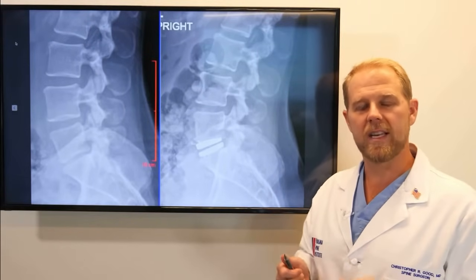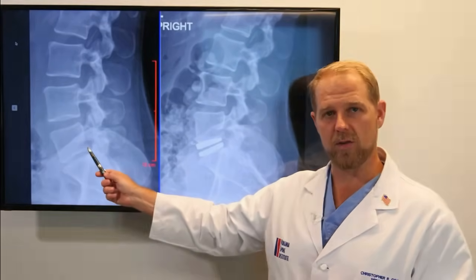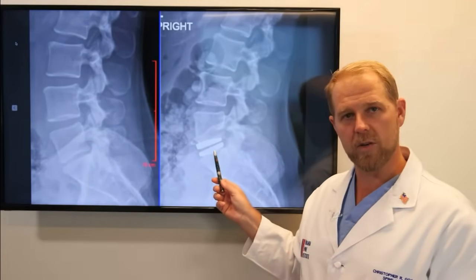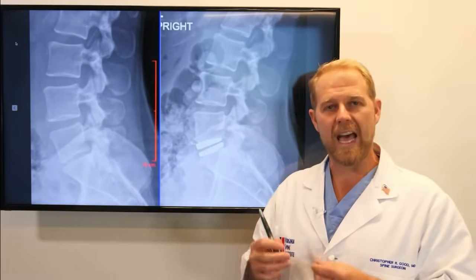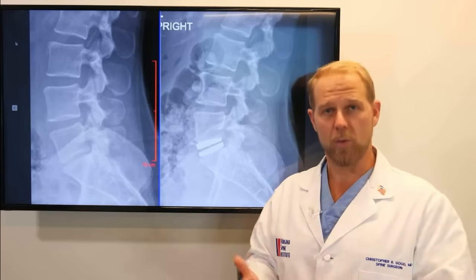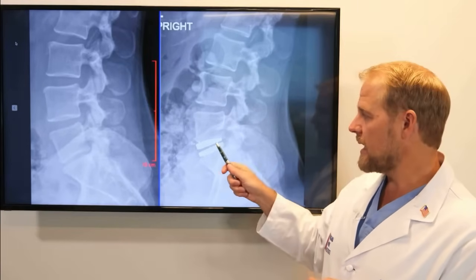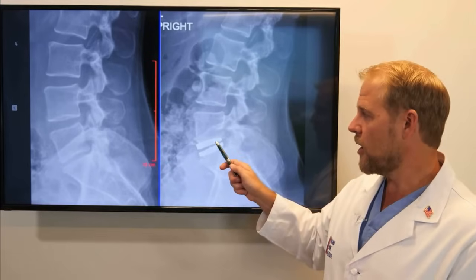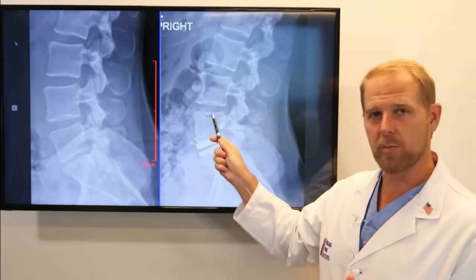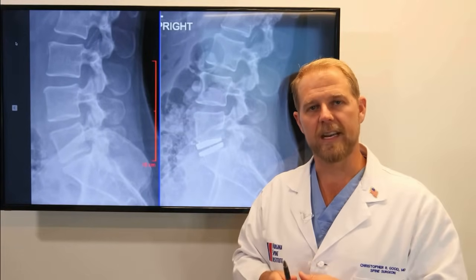This is a great example of a one level lumbar disc replacement that allows us to fix back pain and a pinched nerve while preserving motion. Preserving motion at that disc is important for two reasons: one, it keeps the patient more flexible and moving better now, which is important; but also, keeping movement at this disc will help protect and prevent degeneration and problems at the other discs down the road.